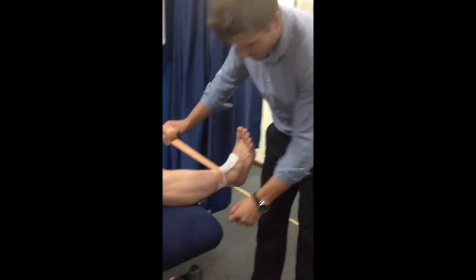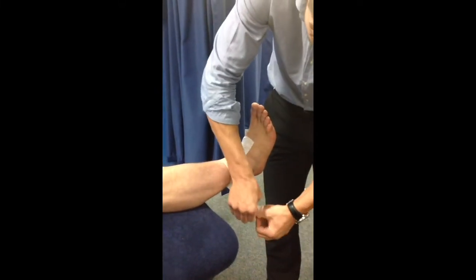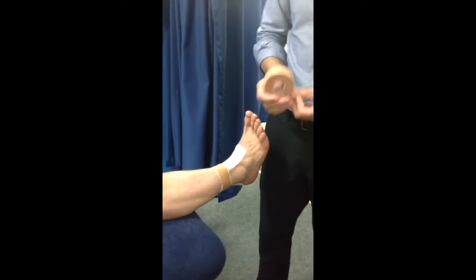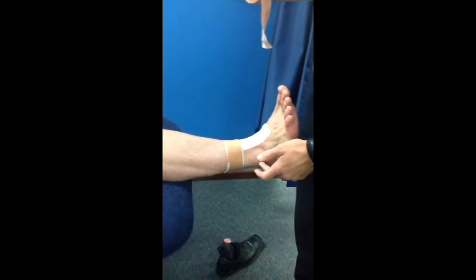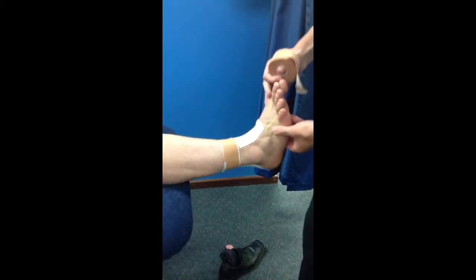As you can see here, we've got the pre-prepared fiximole strips — just for time purposes, we placed them on earlier. We're applying the anchor, not too tight, around three fingers above the bony bit of the ankle. The foot should be in a neutral position.